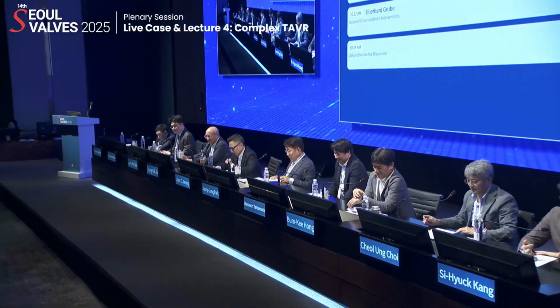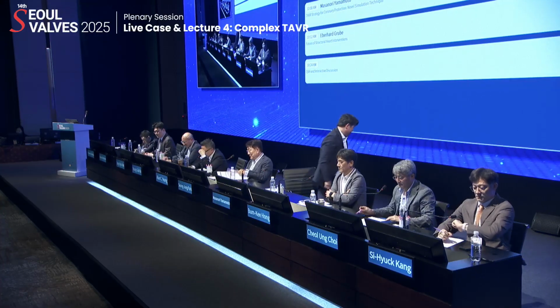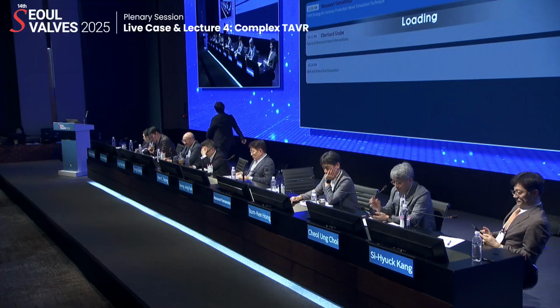Thank you. So why don't we go on to the feature lectures. The first speaker is Dr. Yamamoto from Toyohashi Heart Center, and he's going to talk about TAVR strategy for coronary protection, a novel simulation technique.